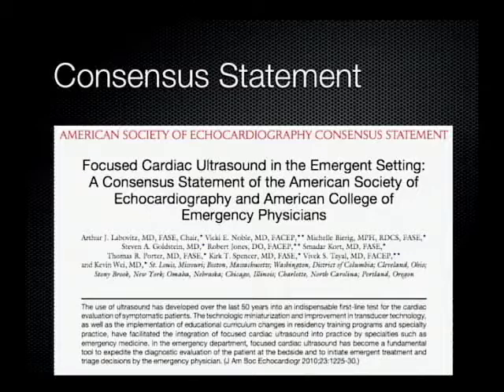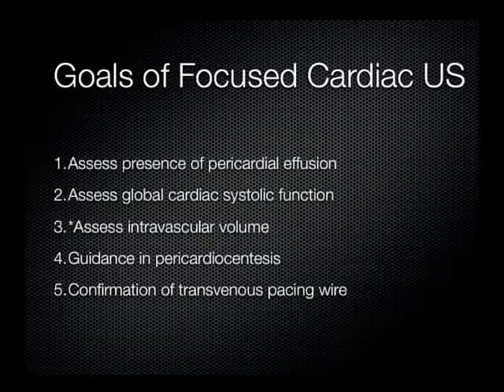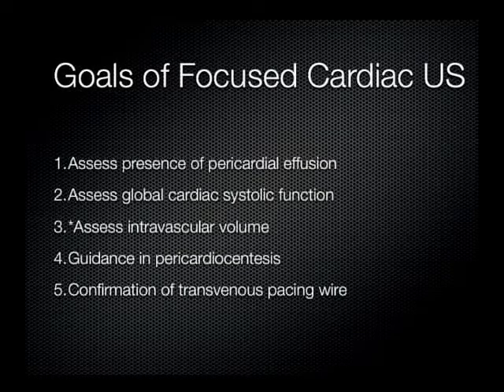The American Society of Echocardiography recognized the need for a focused cardiac examination. In 2010, the Society and the American College of Emergency Physicians published a consensus statement describing the use of a focused exam. The primary goals of a focused cardiac exam are to determine whether or not there is a pericardial effusion and to assess global systolic function. I will be focusing on these two for this lecture.